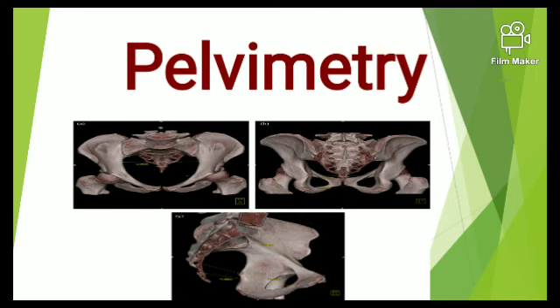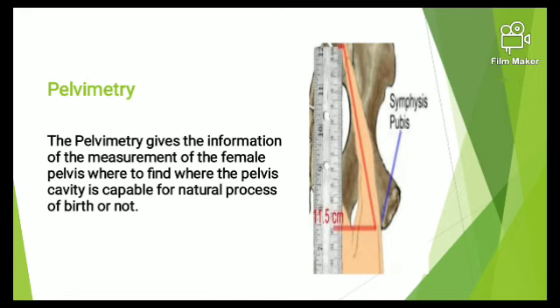And today we are with an interesting topic, that is pelvimetry. Before going to the topic, I hope you are all staying at home and enjoying our educative sessions. Today we will be discussing what pelvimetry is, why it is necessary, and how the measurements are taken in our radiology department. We'll start our session with what is pelvimetry.